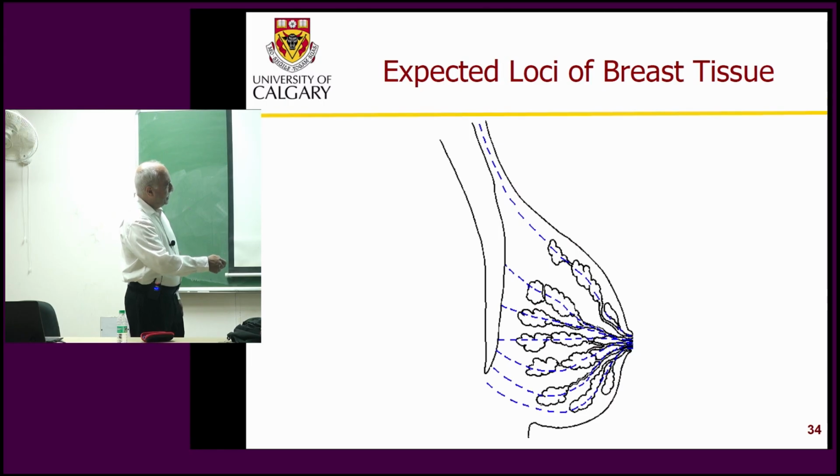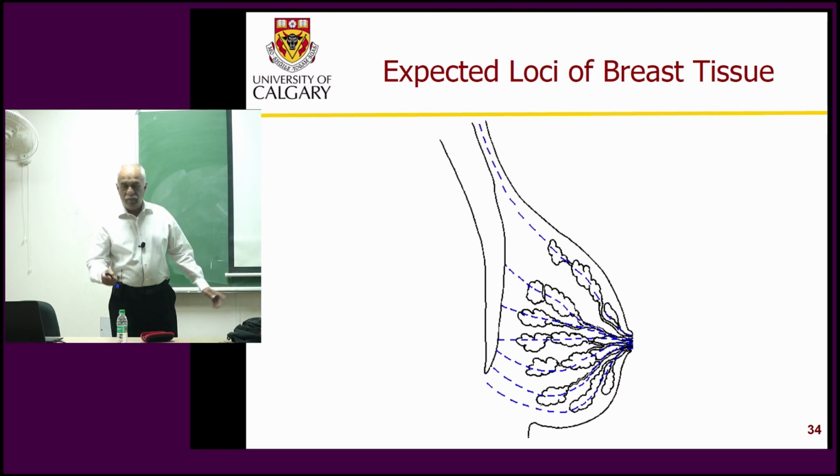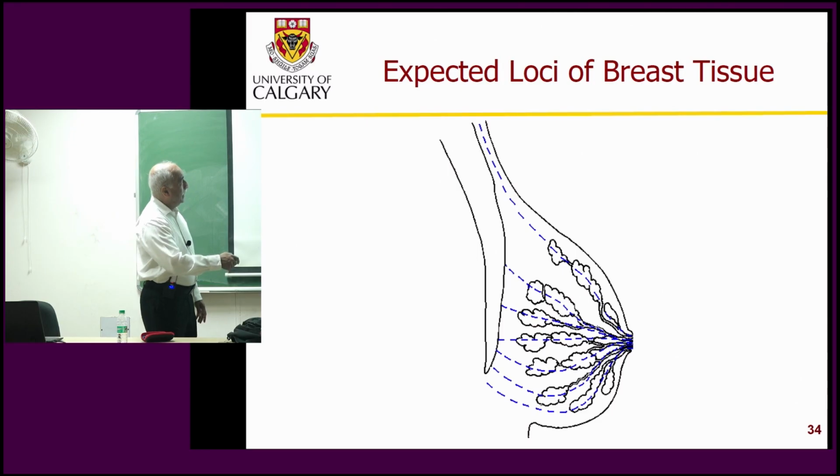Mostly straight line. If you can fit an approximate straight line, that forms a reference to the chest wall. And the skin air boundary or the breast boundary needs to be detected. These are important references for these loci, plural of locus.